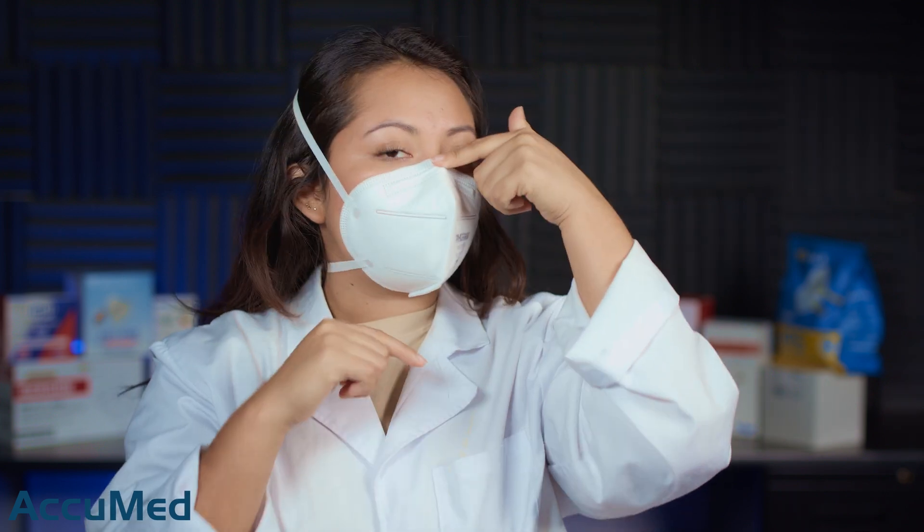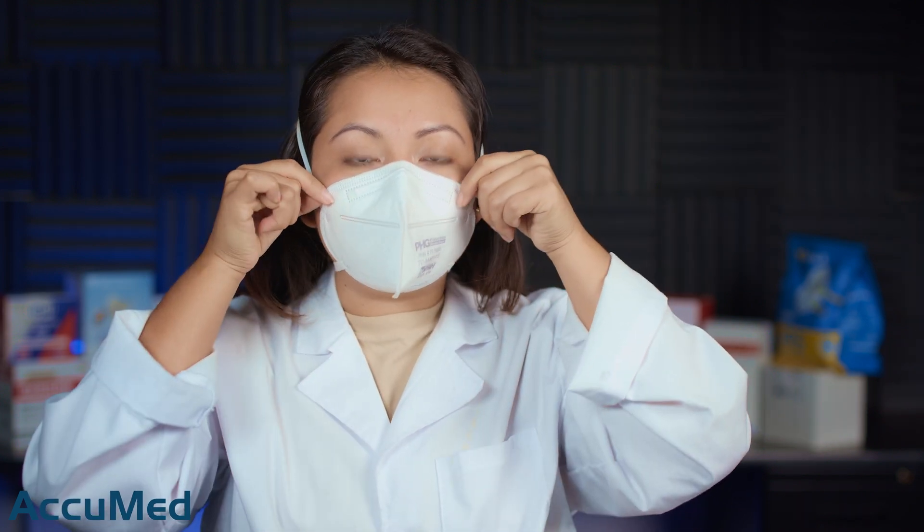I am getting a nice fit out of these respirators. I do feel like it's covering from nose to chin. The seal is very well all over the face, but like I said the nose wire is a little flimsy so it's losing its shape really quickly.